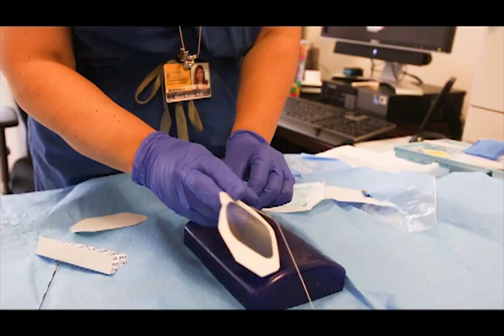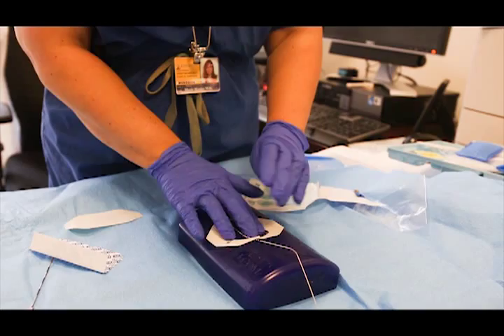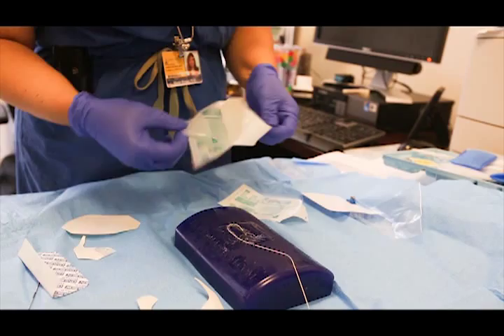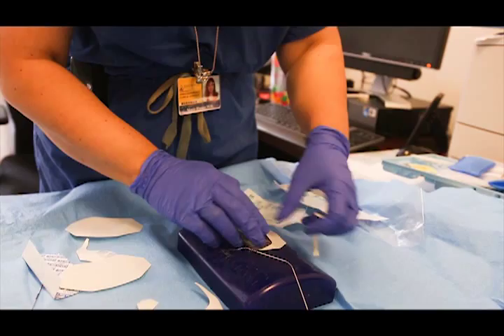One of the right ways: number one is to place a Tegaderm exactly where you want to put it. Make a window for APS to see, get rid of all the bubbles. What I do is put two Tegaderms, not just one, to make sure it's going to be sticky. Get all the air bubbles out.